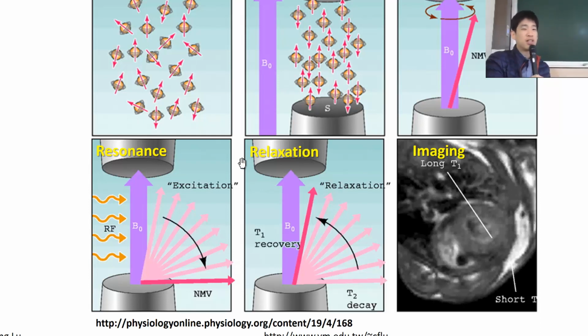So sometimes if we really want to observe or investigate something, we need to give some excitation, or extra stimulus. And this is accomplished by giving an extra radio frequency, we call it an RF pulse. This is just another magnetic field or electromagnetic wave. We use this RF pulse to transfer energy from this wave to the NMV.